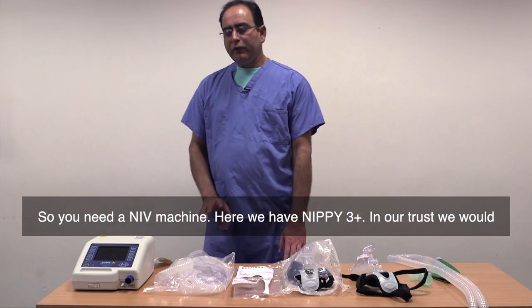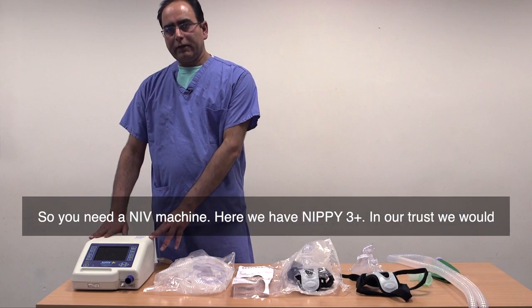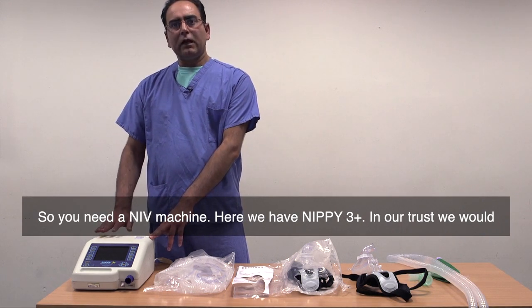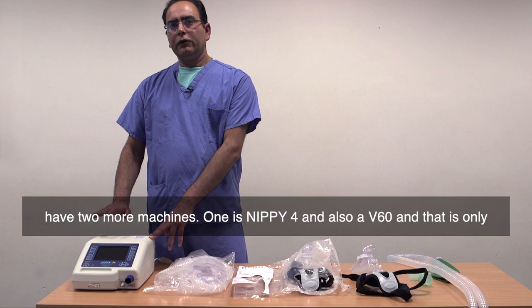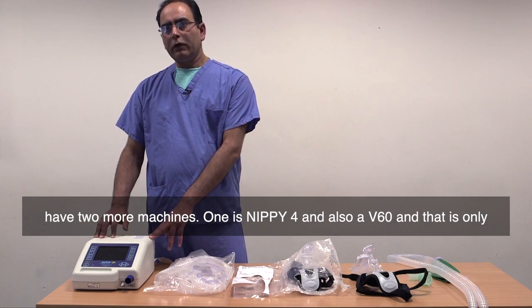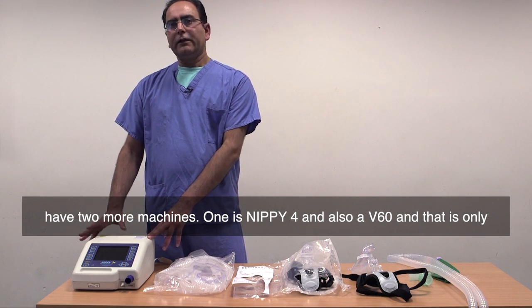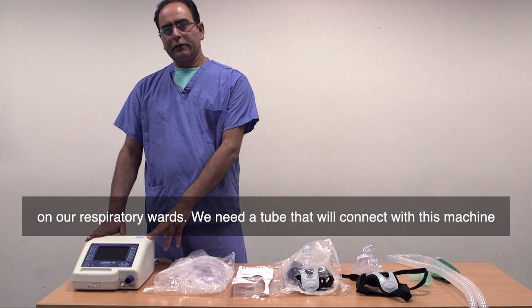So you need a NIV machine. Here we have NIPPY 3+. In our trust, we would have two more machines: one is NIPPY 4 and also a V60, and that is only on our respiratory wards.